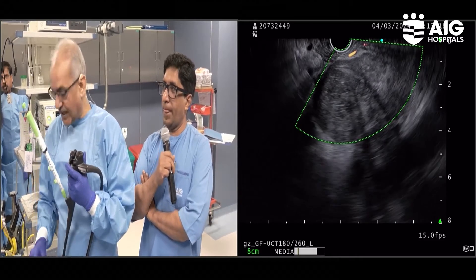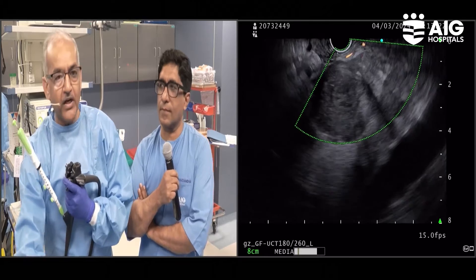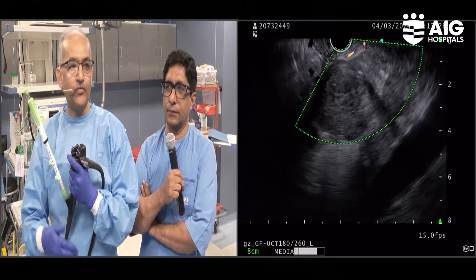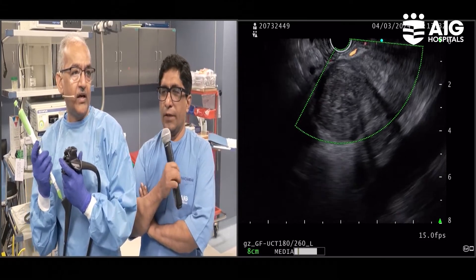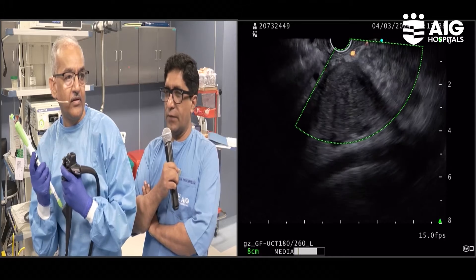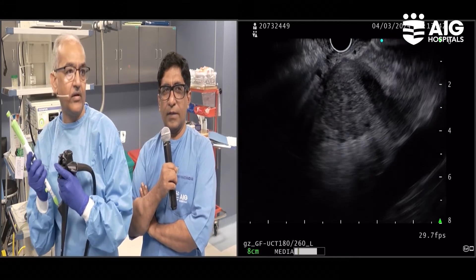Once this becomes standard of care, the image can be transmitted live remotely — within the same hospital or even externally elsewhere. So we need not have a pathologist in the room. They can keep working in their lab and we can send the image while we are working, so that the logistics will be much better.